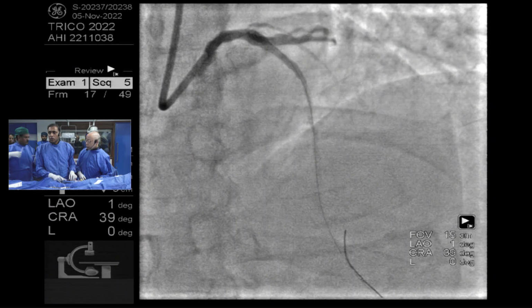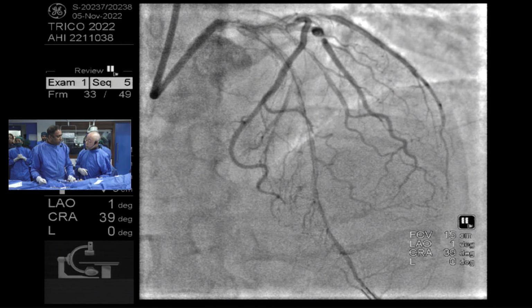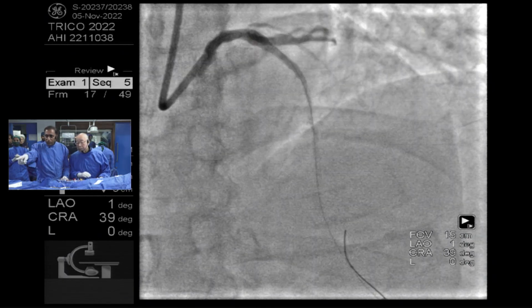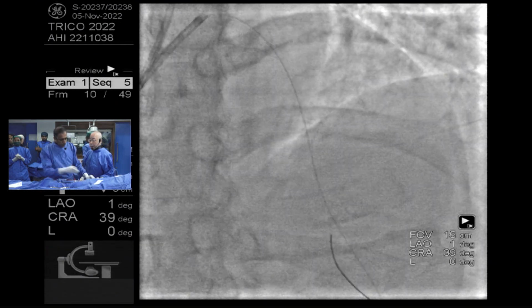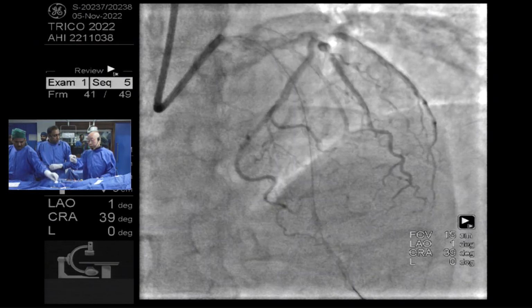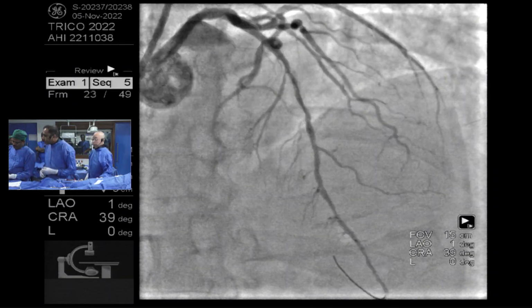Can I have a 2.75 millimeter stent? Length is a long one, 38. 2.75, 38. So the wire is too deep, distal end. And then after placing the stent, I want to observe by IVUS. Okay, fine. I was ready.